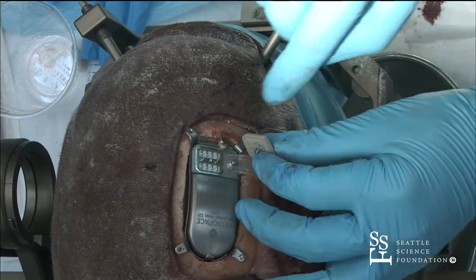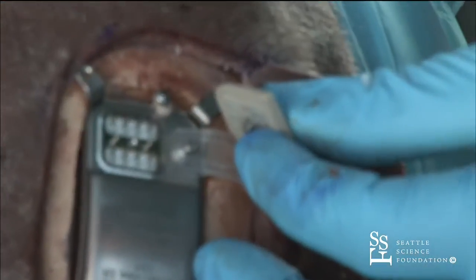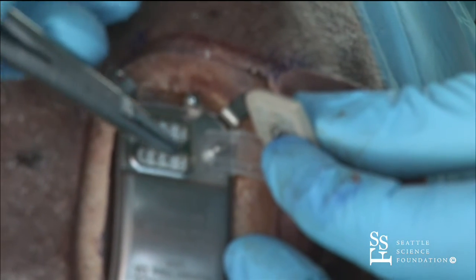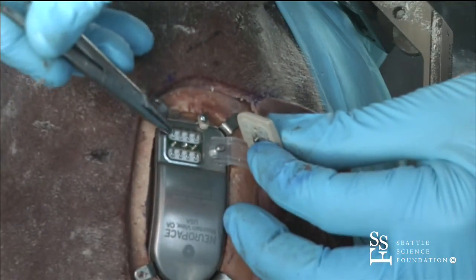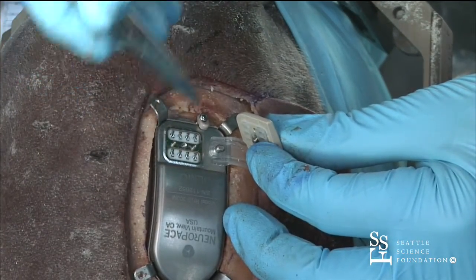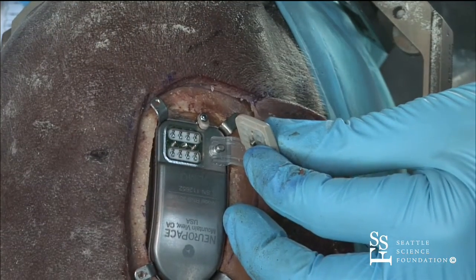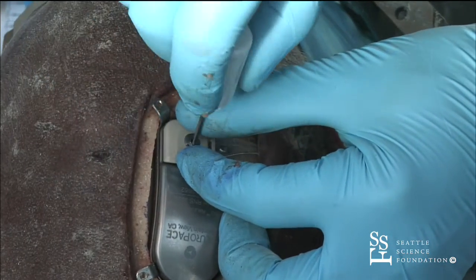Then you can see, if you can zoom up, each of those little metal tines is a contact right here, and so you want to be careful not to let any moisture into this area. There's actually a seal that will go around all of the contacts once it's closed, but you want to make sure to suction all this off and make it as clean as possible before you lock this down.